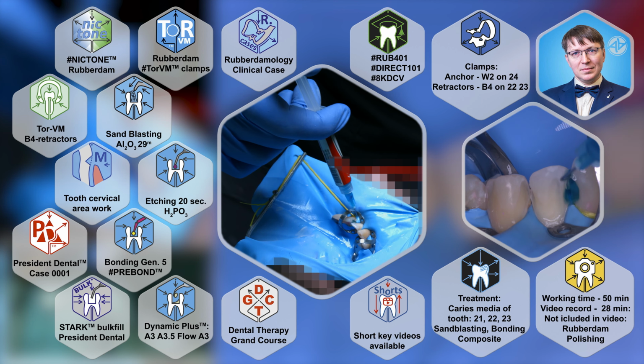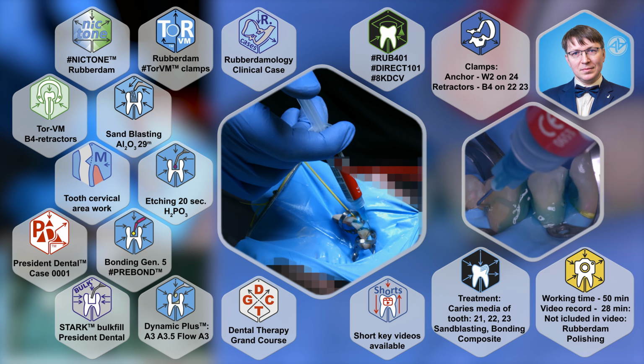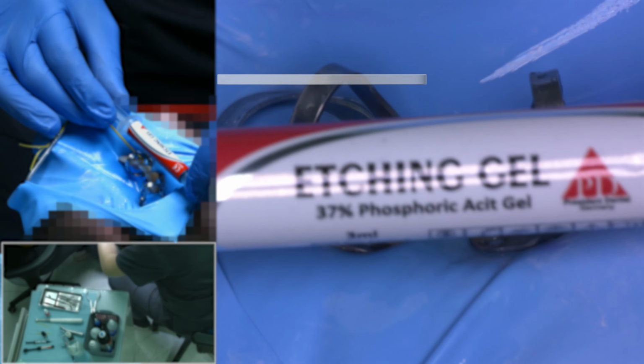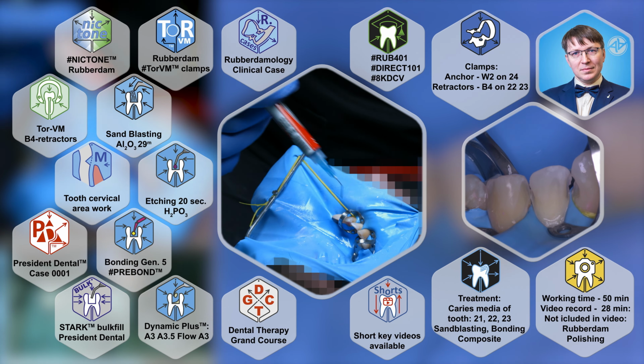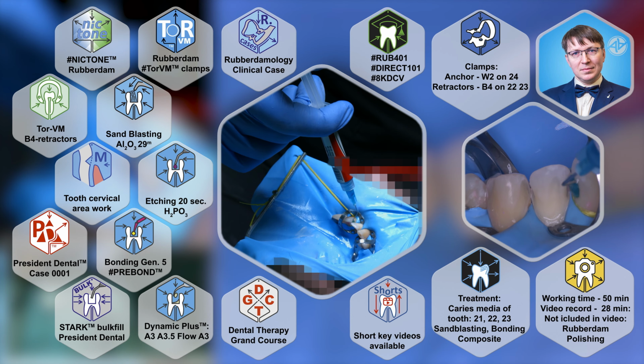And sometimes I did not include in the video some parts like rubber dam isolation or final polishing, because I had no time to do this work at this visit of the patient. I hope you like this animation and it's informative for you.